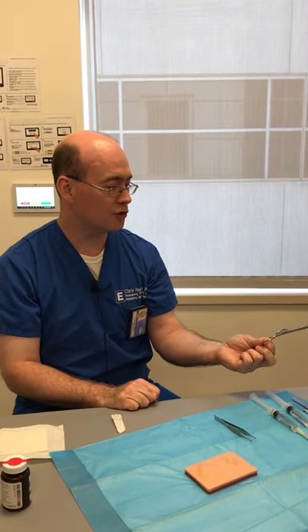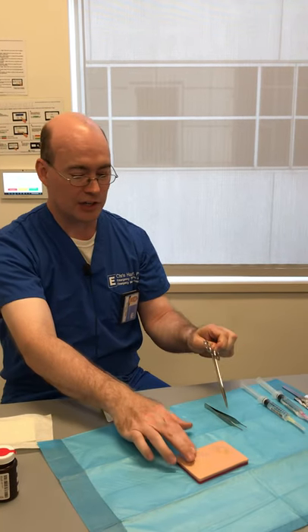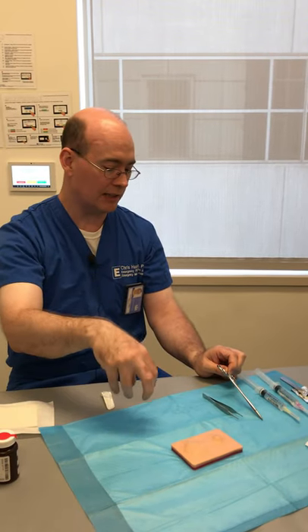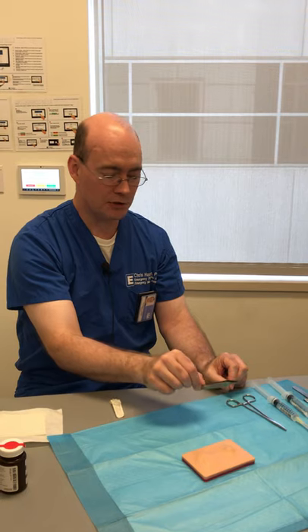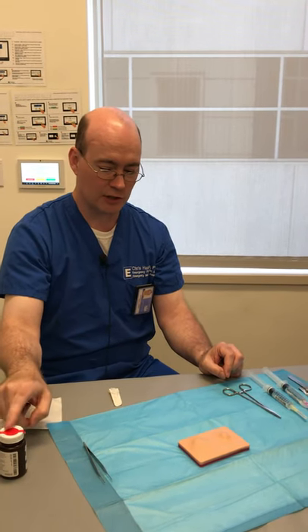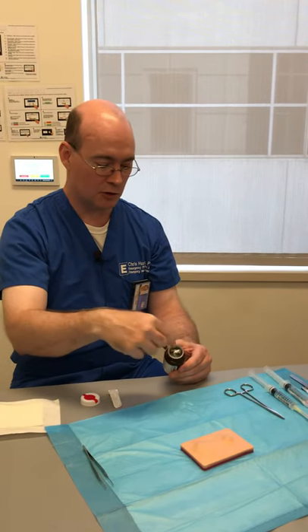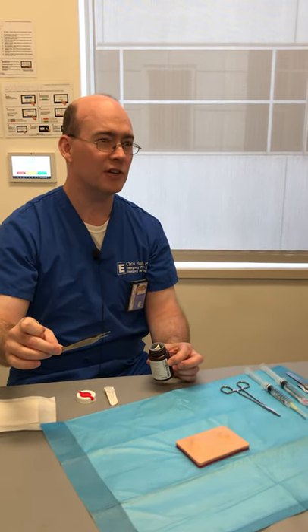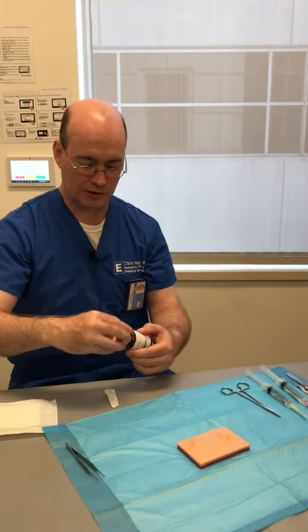You need something to break up loculations inside. In a suture tray there'll usually be a hemostat — you can scoop around on the inside. The stuff in there forms little compartments with fibrinous material, and if those aren't broken down and allowed to drain out the abscess will just come right back. It's good to have some pickups as well — keep those sterile till the end because you'll use them to handle your packing strip, which comes in a bottle. Don't contaminate the top of the bottle. You'll also need scissors to cut the packing.